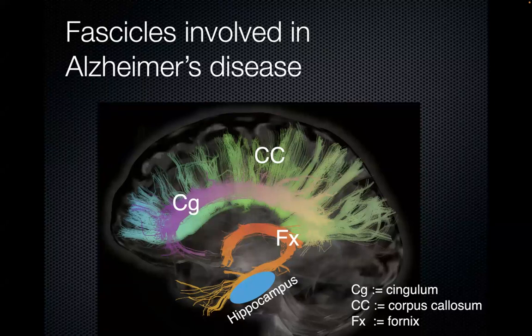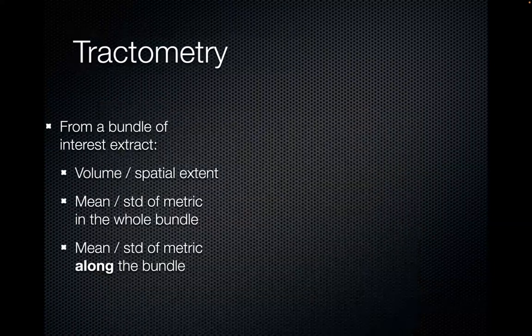So for instance, in Alzheimer's disease, we always go to the fornix, the cingulum bundle, part of the corpus callosum. So now we can run a whole pipeline, extract these features and start quantifying them with disease, with aging, with neurodevelopment, with MS, with Parkinson's disease. And so these tracks of interest change depending on your application, your disease, your project. And this is really possible at the moment.